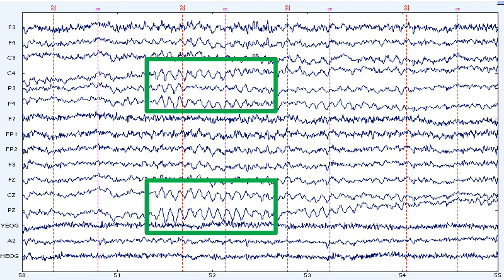Notice the oscillations at these electrode sites here. If you counted, you'd find about 10 peaks in a one second period. That means it's a 10 hertz oscillation. Oscillations around 10 hertz are really common in EEG recordings. They were actually the first feature of the EEG that Hans Berger documented back in the 1920s. He called them alpha band oscillations.